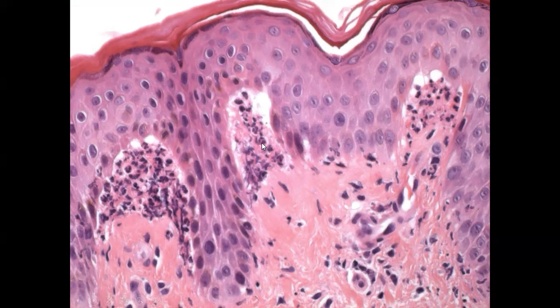So these are small abscesses located at the tip of the dermal papillae, and these are not in the form of large blisters. If we see large blisters with neutrophils, your first histopathological diagnosis would be linear IgA disease.